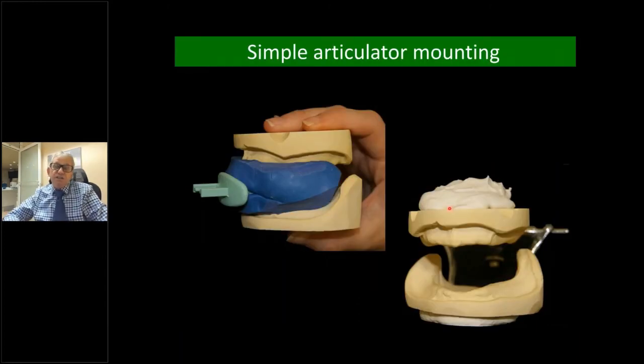I always use a semi-adjustable articulator, but it really doesn't matter. All we're wanting is this space. I'm just wanting that space right here. So we're going to turn around and just put it on a simple articulator or semi-adjustable, and then we're going to build the upper occlusal rim or the ECB to your measurements, and then what's left, we're going to make the lower occlude against it.